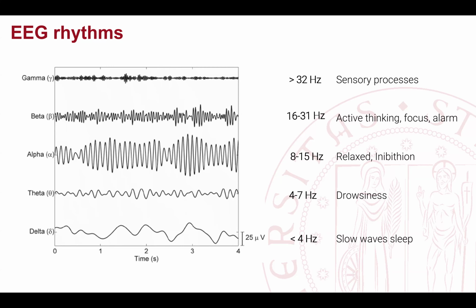So this seems very useful because you can now filter your signal and associate it to each rhythm as a sort of component, but actually this is just a convention. Okay, so again, it doesn't work like that. It is a convention that neuroscience introduced, of course, to simplify a little bit of clustering and description of what happens at the behavioral level, but it's more complicated than this.